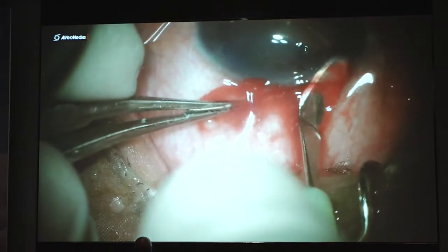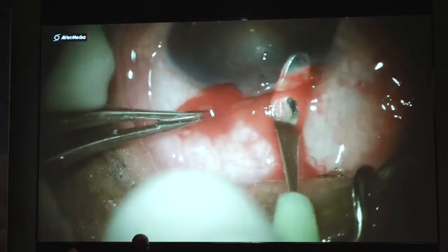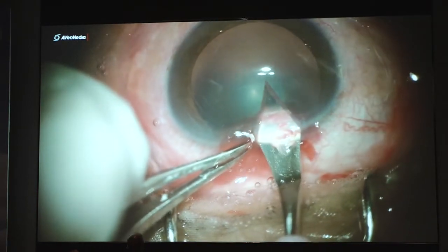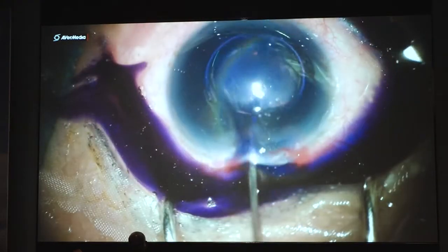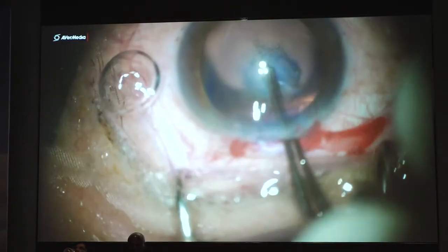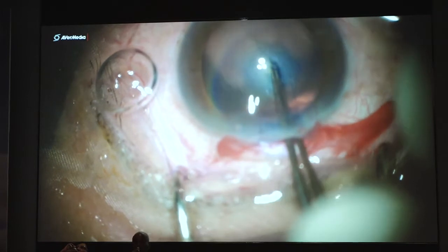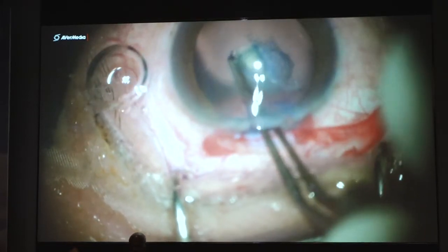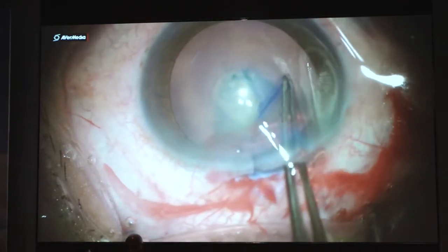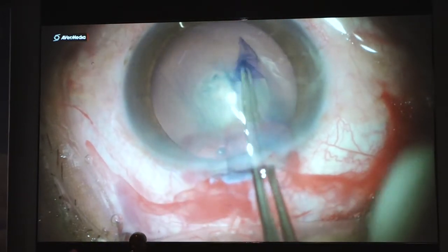salute sign. So what I do is that I take the chopper from one side, from the other side I crush it. It breaks into 2 like you do in a high vacuum phacoemulsification. Then you simply take out the nucleus without any problem, and the surgery is excellent. The phaco energy is also almost not there. So that can be done.